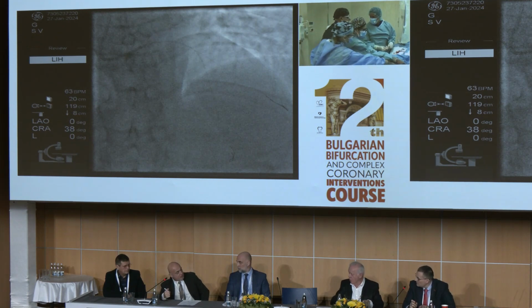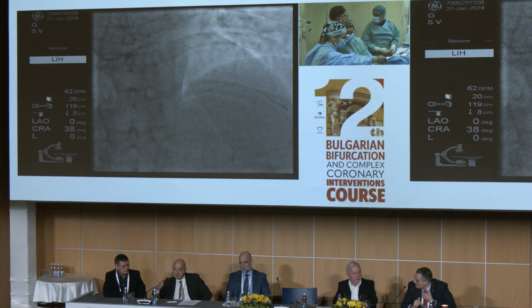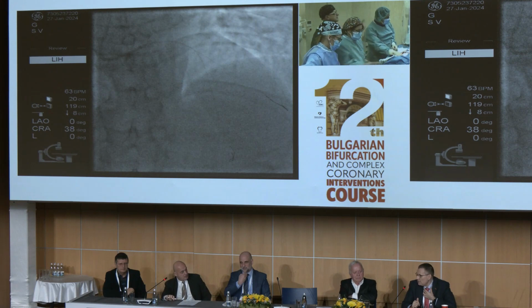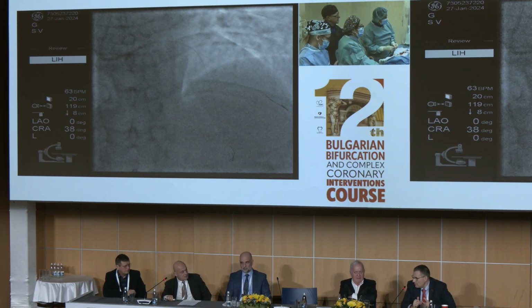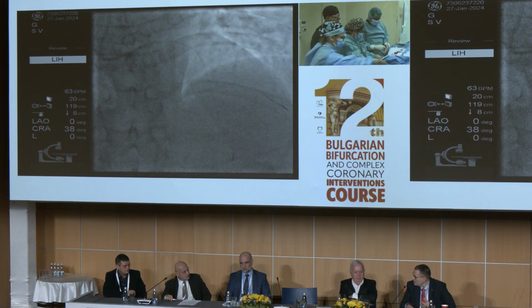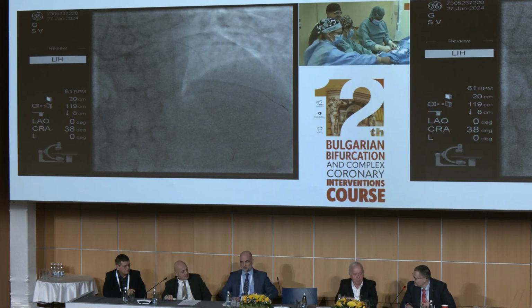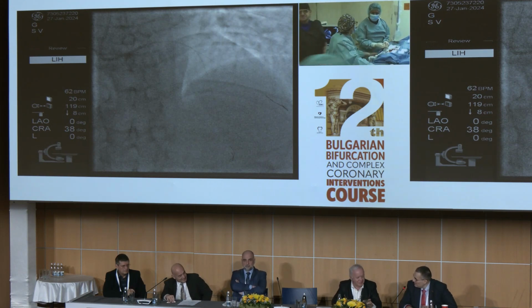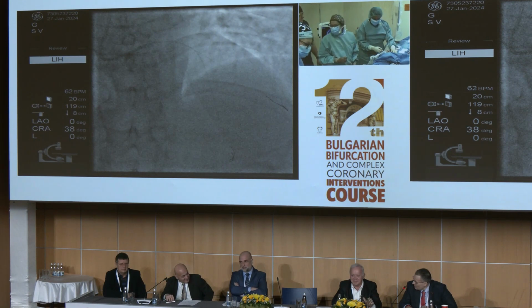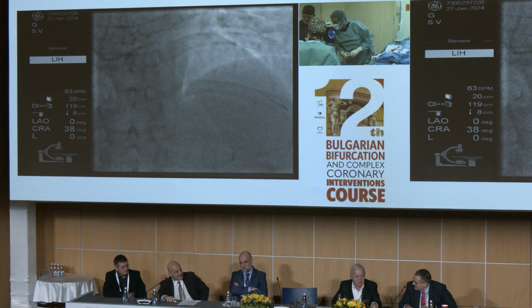You can make registration also manually, not only pullback. Very good. You can do it actually with engineers, because I work a lot with this IVUS, and with the company we made something off-label. We disarranged the pullback machine and made a modification especially for the manual assessment.